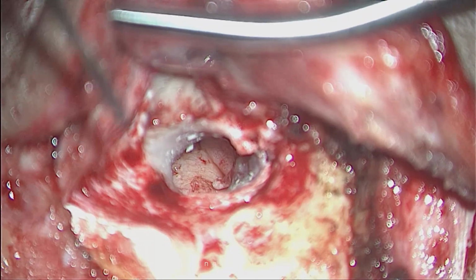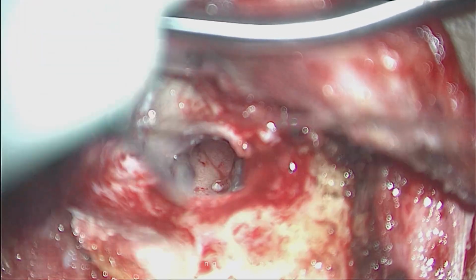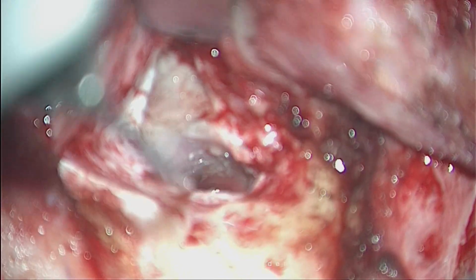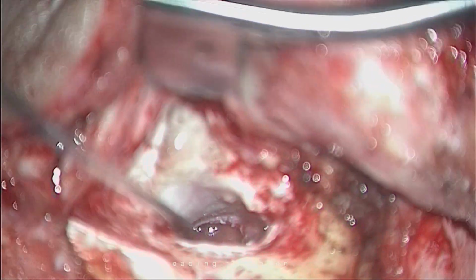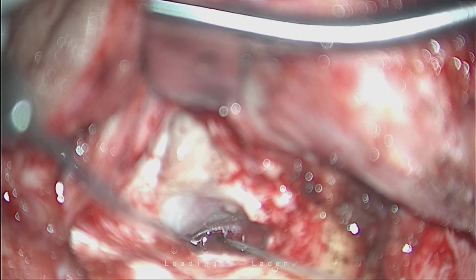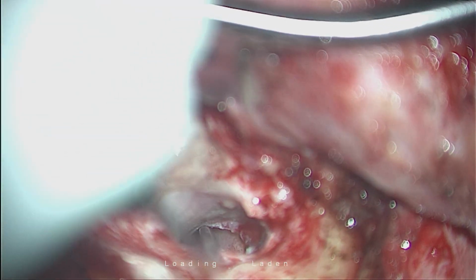See this, wash. See the canal, good canal, and you can even see the Eustachian tube area. We always flush this Eustachian tube in all cases. Many times you get foreign bodies, sometimes purulent discharge or anything which can plug the Eustachian tube.